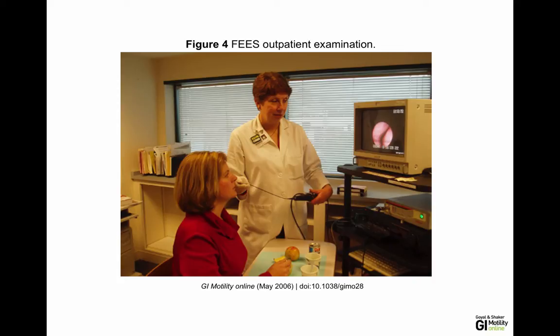So here we see a clinician, and I believe it is Susan Langmore, who is using an endoscope to evaluate the person who's seated at the table. She will be giving her instructions about what to do and what not to do, and she'll be narrating at the same time. So when she goes back later to view the film, she'll have an auditory log of what they were doing at the time the film had taken place. So again, you can see if there was a small monitor and a packaged briefcase arrangement of the computer aspect, you could very easily travel with this assessment procedure.